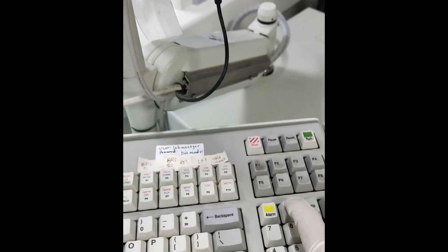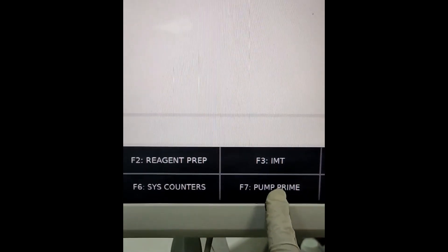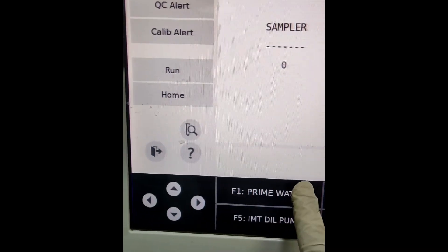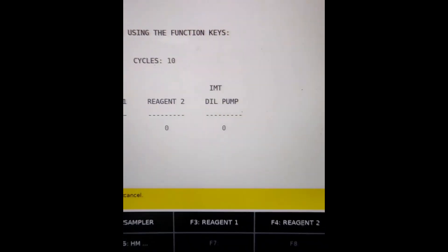After cleaning the probes, we begin pump prime for 10 cycles. We also need to check the reagent tray and cuvette temperature. After doing pump prime, we will perform a CHK test and then run QC.